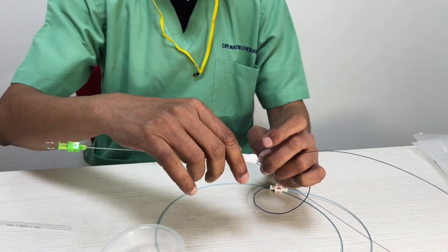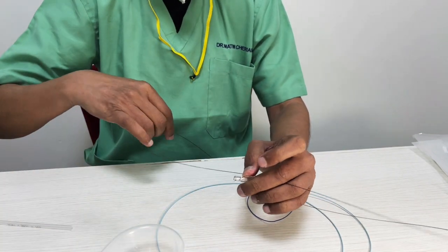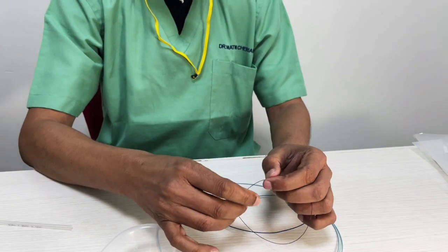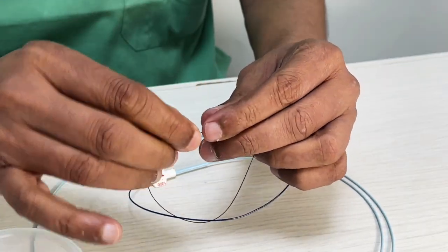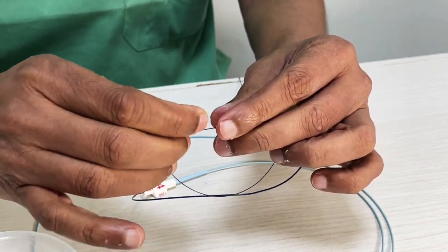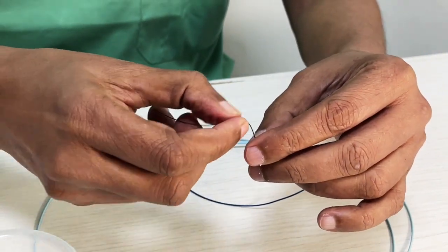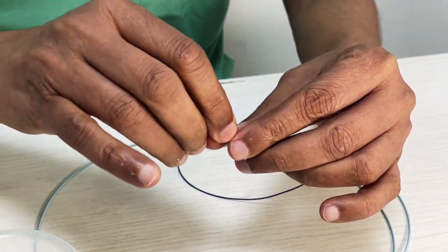If you're going to use the wire, you obviously have to take this out and you use a wire. Like I said, this is not the ideal wire, but if you're going to work in the 2.1 microcatheter, the wire that we use, even a neuro micro wire, will be fine. So you just push it and it will start going in. Technically not a big job, very similar, only thing is you're shifting the wire a bit. So just push it and after some time, obviously the coil will come out. But I want to show you the other technique, which is very fast.